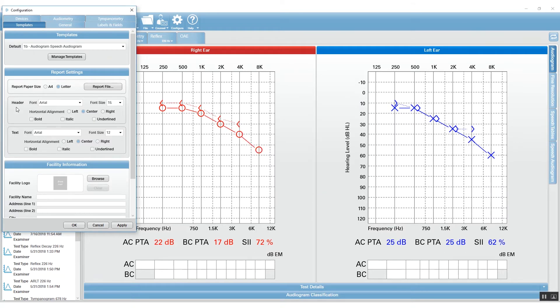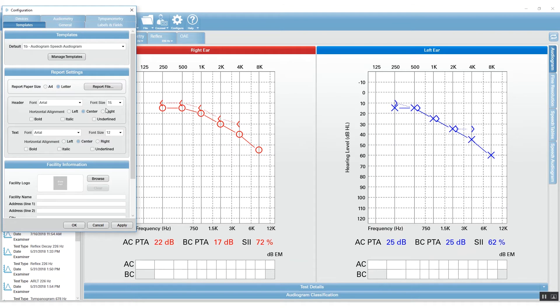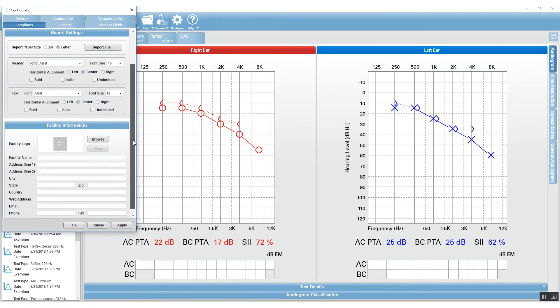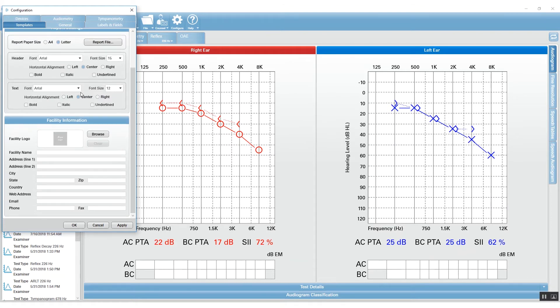You also have options to set your header and footer and your text font defaults. You can set your font style, font size, and alignment for each one of the components inside the template editor.